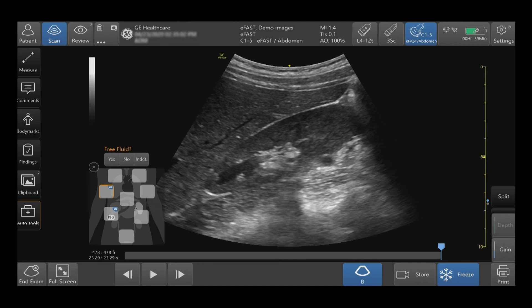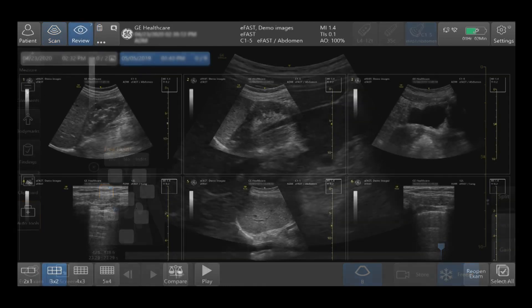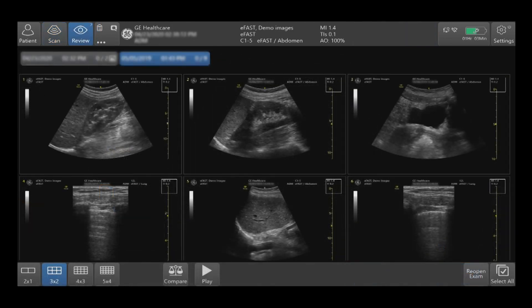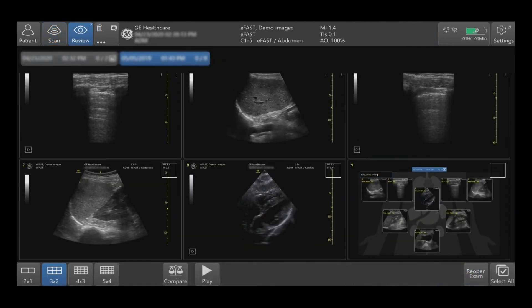Continue your eFAST exam and store your images into the diagram. Upon completion of the eFAST exam, you can now review the eFAST diagram by selecting Review on the top left hand side of the touch screen. Scroll through your images to locate your eFAST diagram, then select by double tapping to display in full screen.